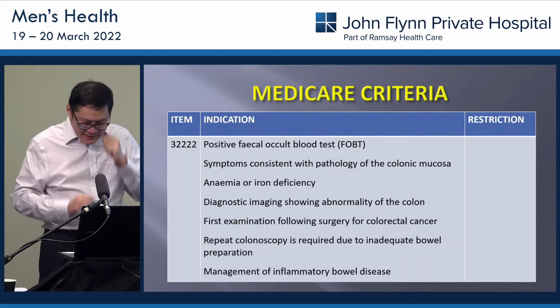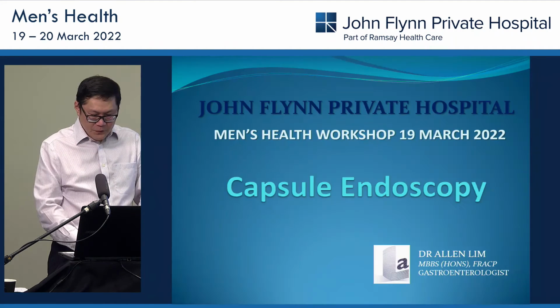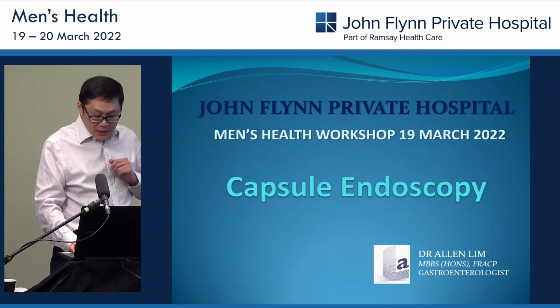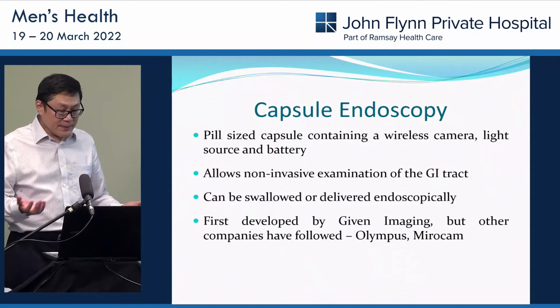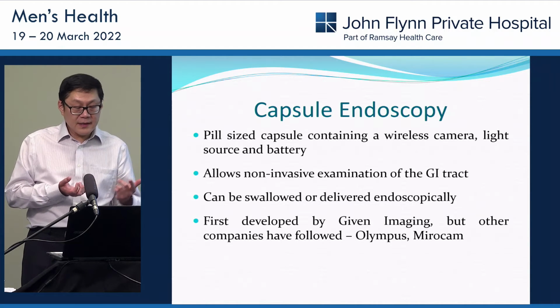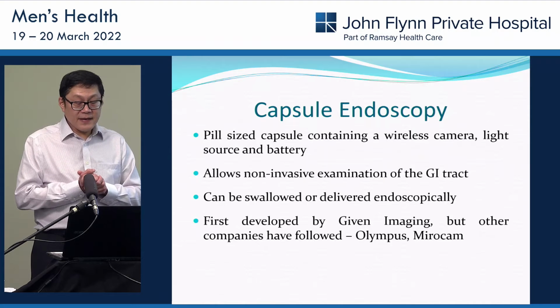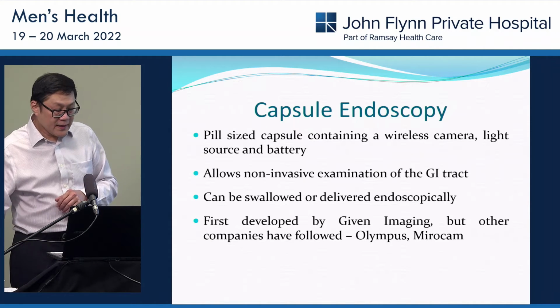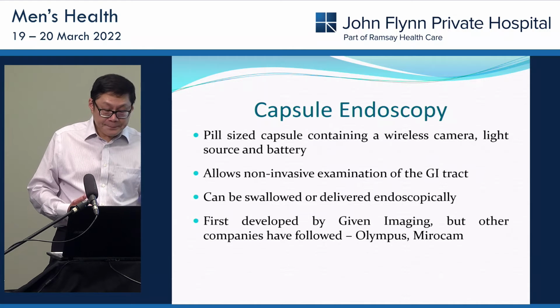Okay, well, I guess in that case, we'll move on to the next topic. All right, so the second part of my talk will be in relation to capsule endoscopy. So what is capsule endoscopy? It's a pill-sized capsule that contains a wireless camera, a light source, and a battery. This allows a non-invasive examination of the GI tract, and it can be swallowed or delivered endoscopically.